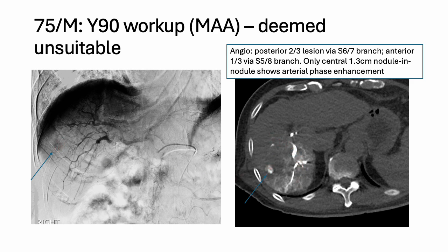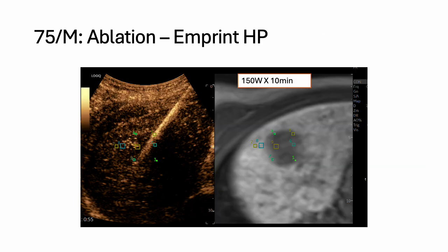and it was hard to get adequate dose to the tumor and spare the liver, because the liver function was slightly deranged and we did not want to damage too much of the liver with Y90. And so the decision was made to do an ablation, even though the lesion was larger than 3 centimeters. Actually, when the patient came, the lesion was already 4.1 centimeters.